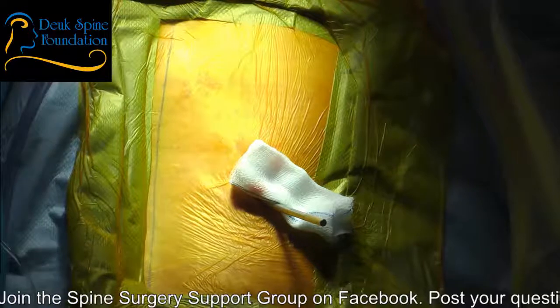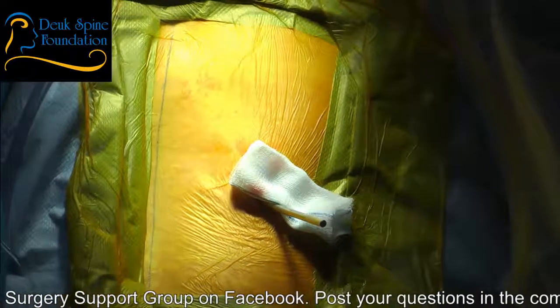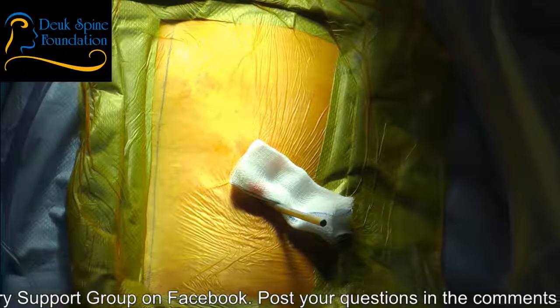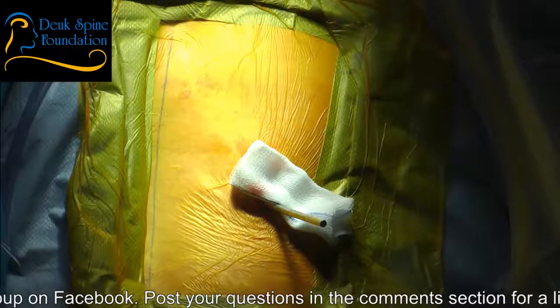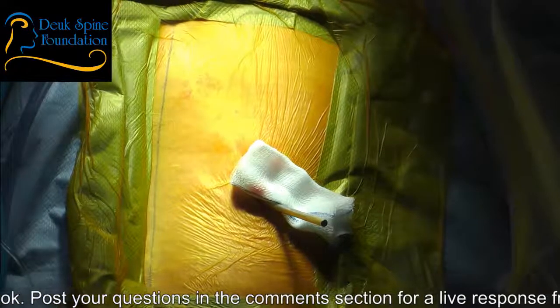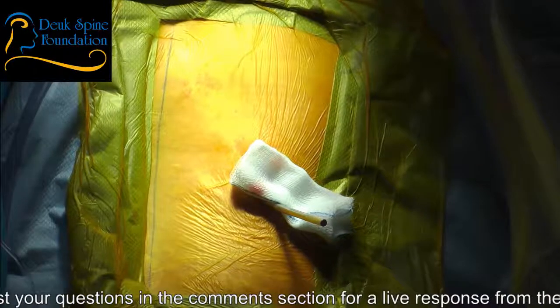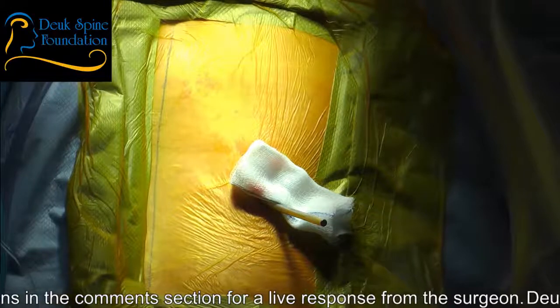And the facet is really abnormal. So basically it starts pushing your needle, right? And your needle is kind of flimsy compared to all that bone and scar tissue down there. So the best I could do is get to the back of the disc with the needle and guide wire. I was underneath the L5 nerve root that's exiting on the left side because he didn't have any leg symptoms.